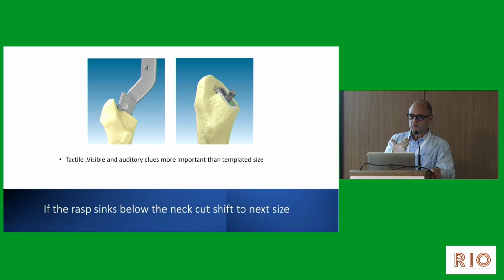Don't go too anteverted. I had a patient where I anteverted more and we got an anterior dislocation even in supine position. So if we do follow all these parameters, we'll get a good cup position and inclination very often.